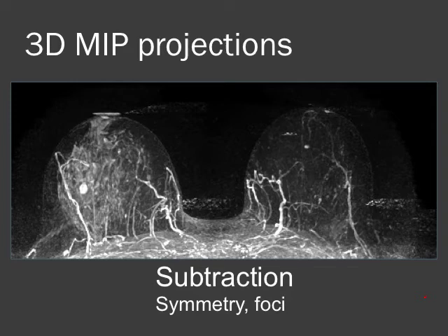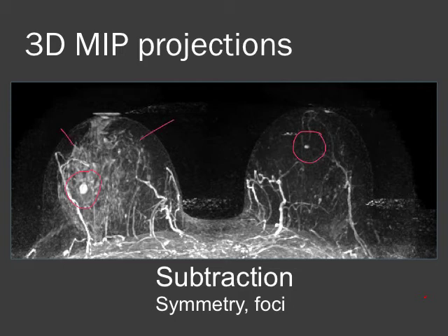3D MIP reconstructions are extremely helpful. In this different patient you can see bilateral breast masses really jump out compared to the background diffuse enhancement in the right breast and the blood vessels. These are 3D and can be rotated as needed.